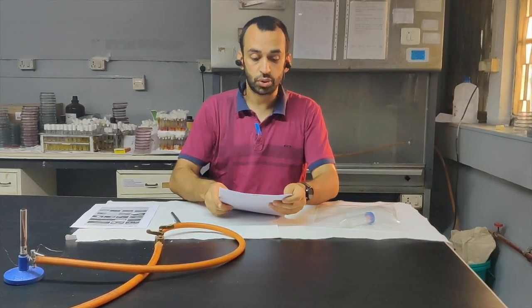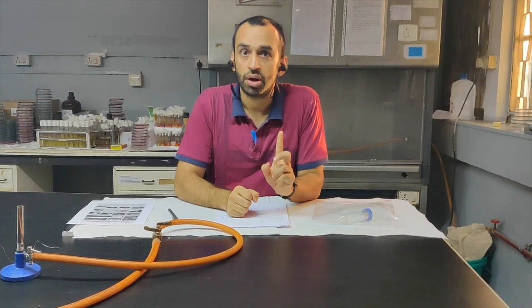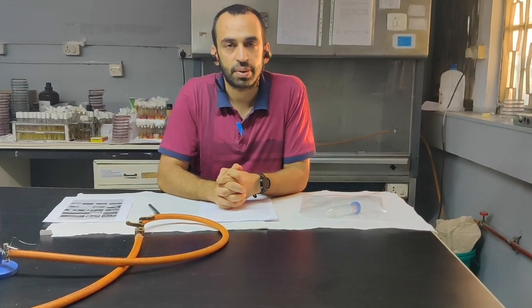You have to remember 2 things. First, the form has to be filled before you handle any sample, or before sample collection. The second thing is that if you are collecting the sample before filling the form, then you have to collect the sample, discard your personal protective equipment completely according to biomedical waste management of St. John's Medical College, and then wash your hands and then fill the form. Please make sure that the form is not filled with the hands which have the same gloves which have been used to collect the sample of the patient.